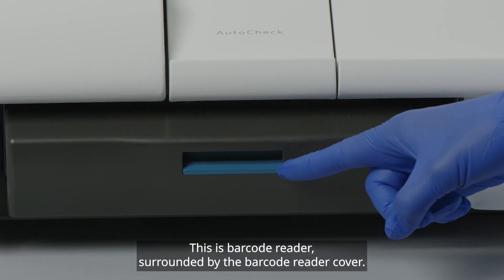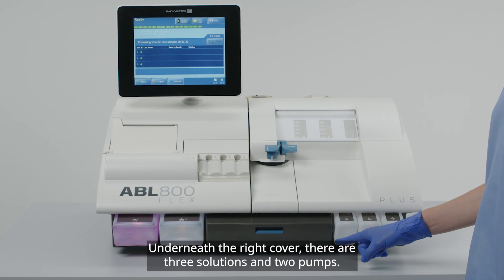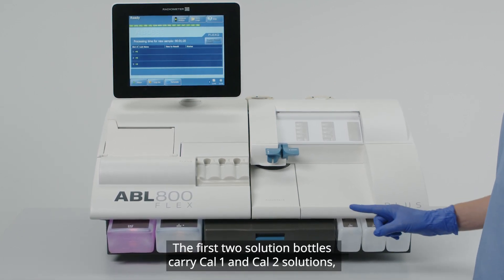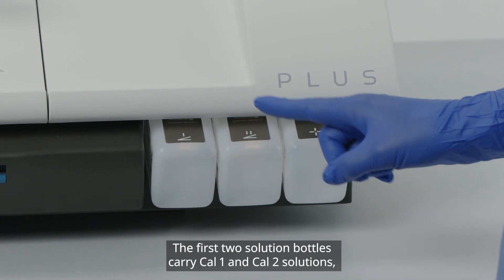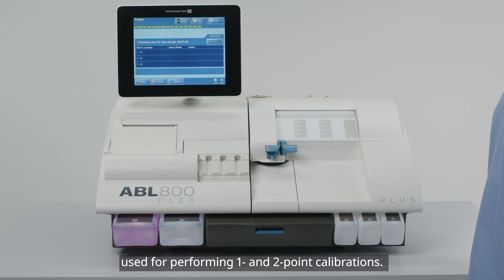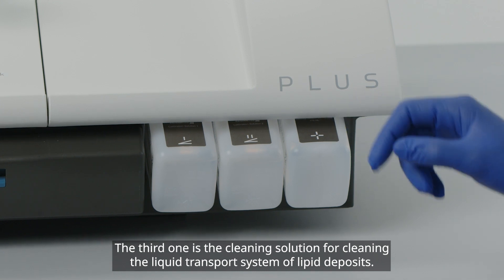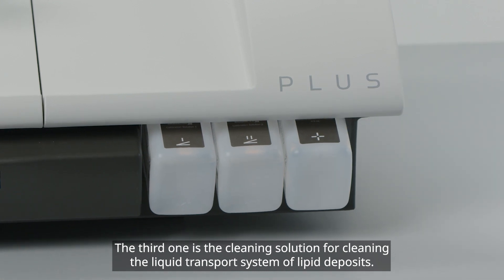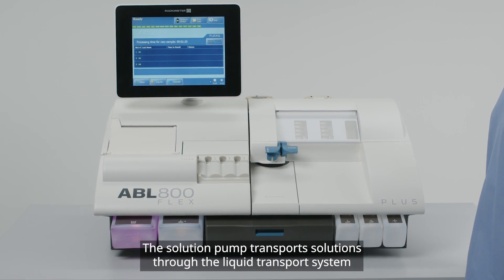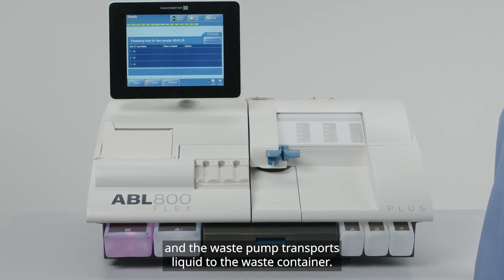This is the barcode reader, surrounded by the barcode reader cover. Underneath the right cover, there are three solutions and two pumps. The first two solution bottles carry Cal-1 and Cal-2 solutions, used for performing one- and two-point calibrations. The third one is the cleaning solution, for cleaning the liquid transport system of lipid deposits. The solution pump transports solutions through the liquid transport system, and the waste pump transports liquid to the waste container.